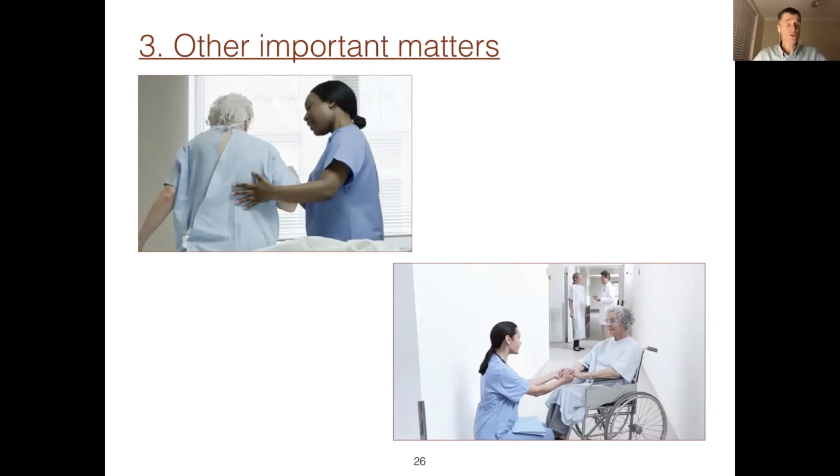The report will go straight to the cardiologist or the referring physician, and he or she will be able to tell you more. It's not our role to be deliberating on what might or might not happen. It's our role to provide quality images and measurements, and then a well-written report to the appropriate person, obviously making things very clear as outlined above.